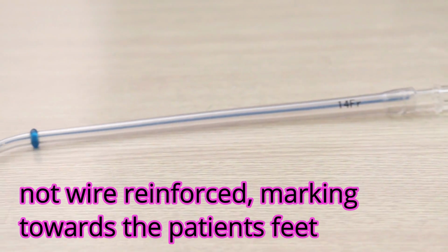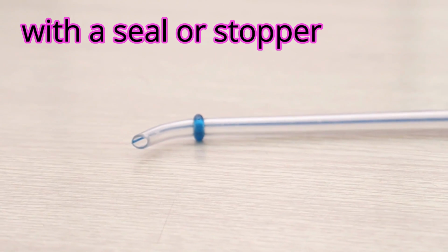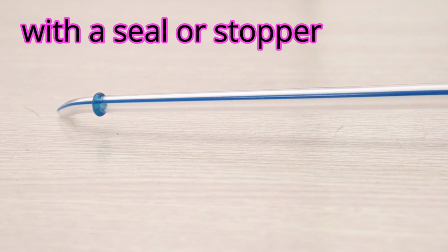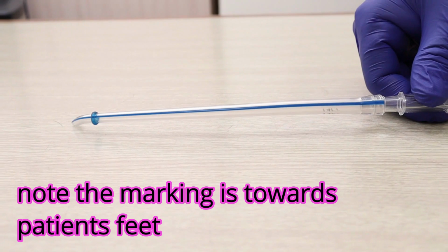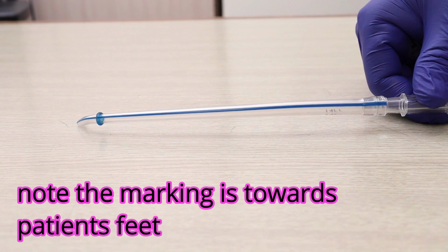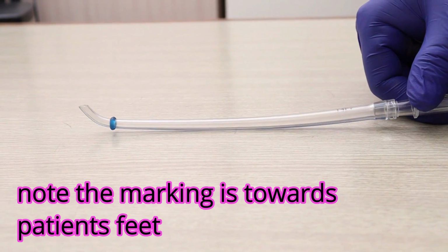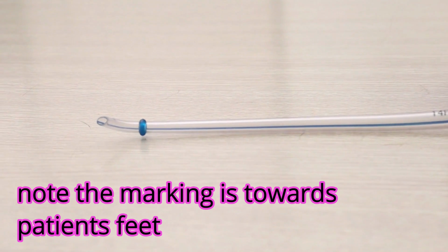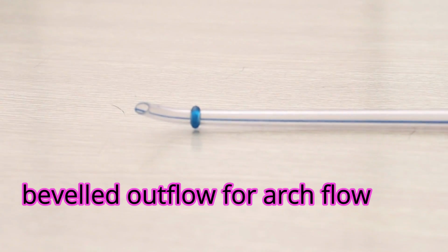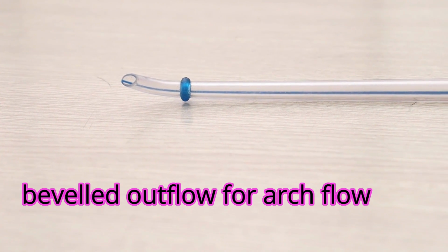It can be directed towards the arch or away from the arch, and based on the marker you have to place the cannula within the arch to have optimal flow from this cannula. It's not wire reinforced. It's likely to get a bit supple as the case progresses because of the patient getting rewarmed. So the marker in this particular cannula is away from the head end of the anesthetist. So one has to really make note of the marker and place the cannula accordingly to have optimal flows.